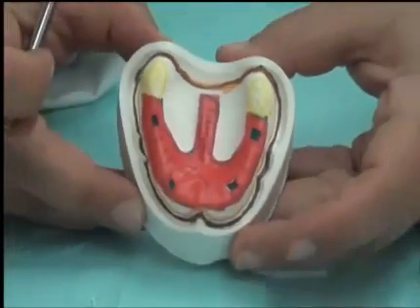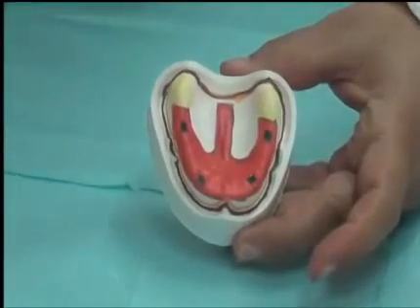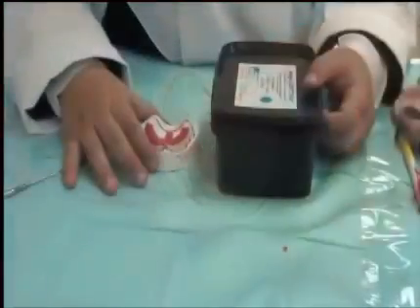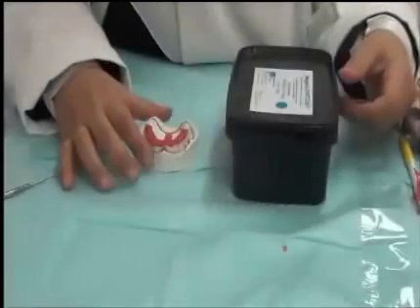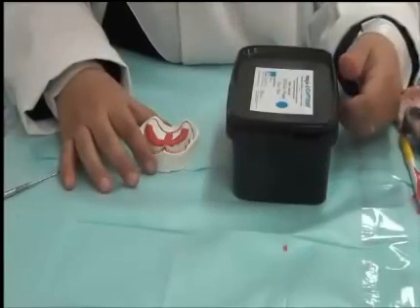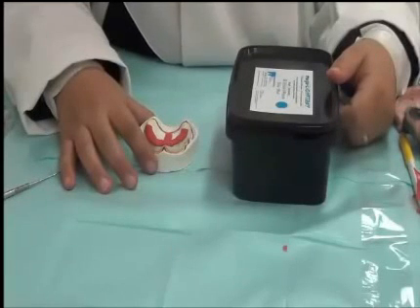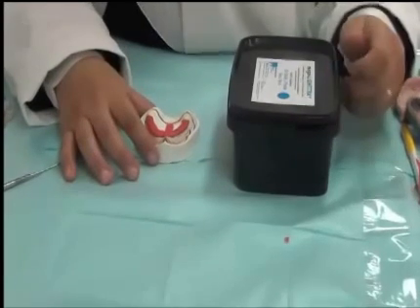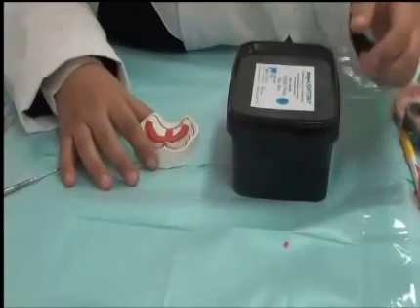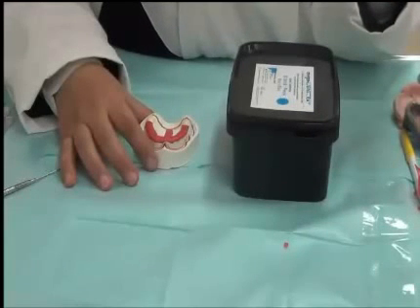Now you are asked to do the wax adaptation for the partial relief of the upper. Now we're going to do the step where we're going to construct a tray over this space. For trays, we need them to be hard and rigid. So we use a material that is easily shaped, and once it's set it becomes hard, and the suitable material is acrylic. Acrylic can come in light cure or in cold cure method, powder and liquid mixture.